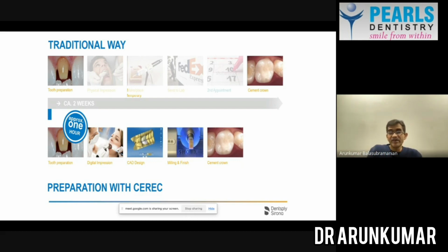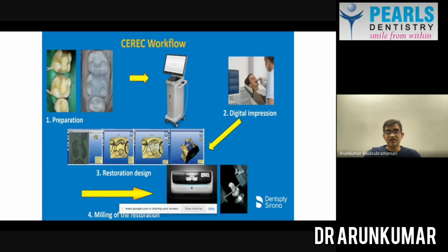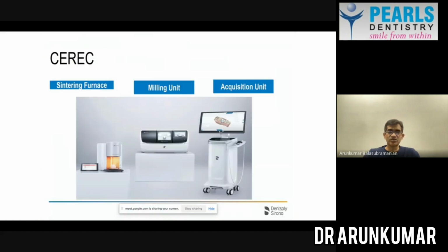Here, it can all be done within 1 hour. So that's the advantage of using CEREC to do it. So that's the workflow for you. We prepare, we scan the tooth, as I said, and then we design, and then we restore it.